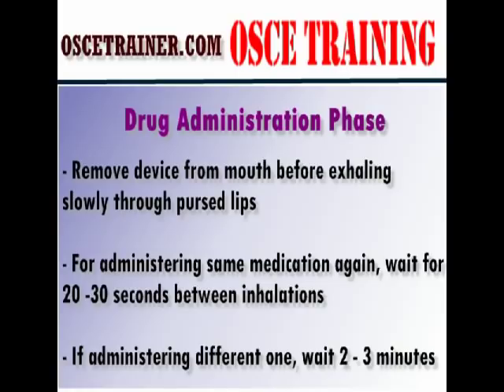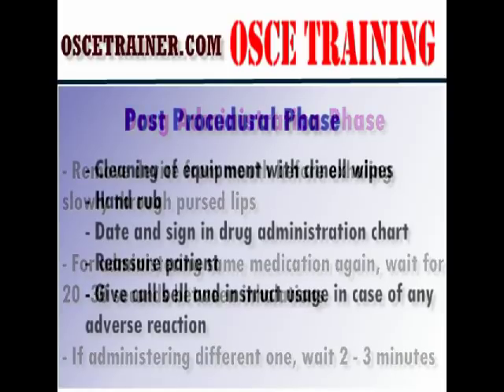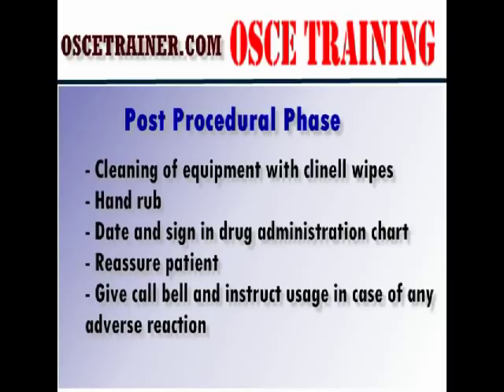If you need to administer one more puff of the same medication, instruct the patient to wait for 20 to 30 seconds before inhalations. If you need to administer a different medication, you need to wait 2 to 3 minutes between inhalations. Moving on to the post-procedural phase, tell the patient that you will clean the equipment, make it ready for the next use, and you will come back.